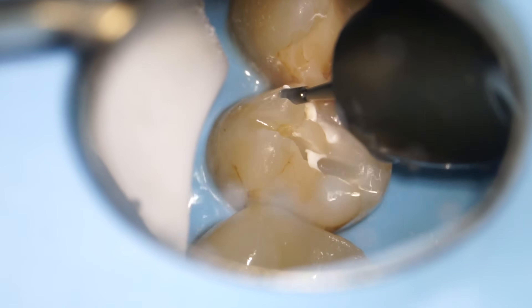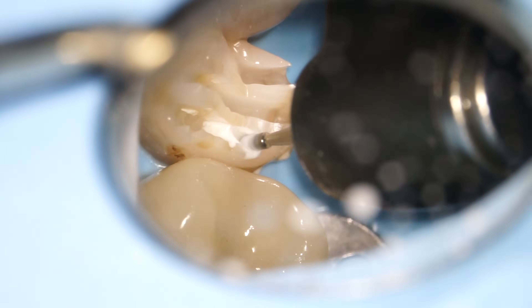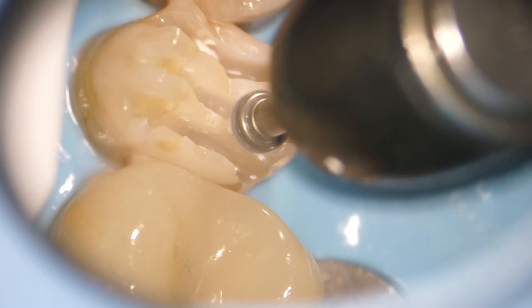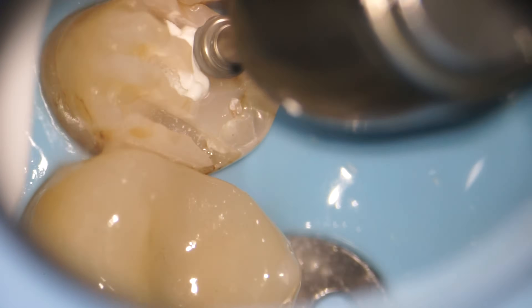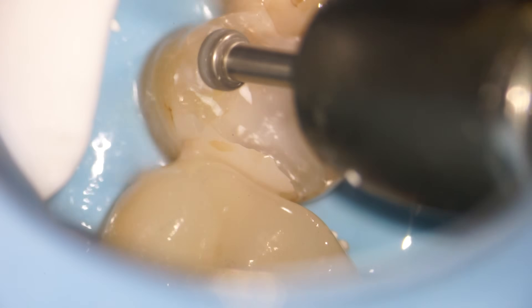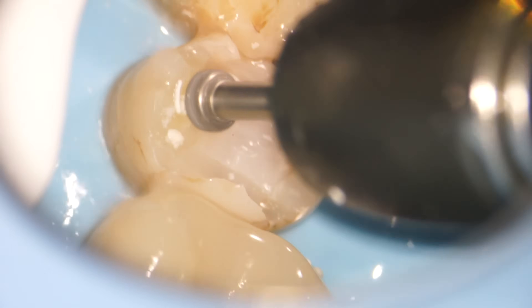I know that sounds like a lot, but the porcelain that we're going to be putting on needs to be two millimeters thick to stay strong and not crack. It's also important that we have a nice smooth surface all the way around, so we spend a lot of time in the dental crown procedure just trying to make sure everything is nice and smooth.